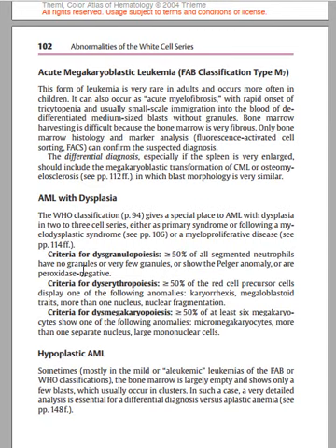The second one is the criteria for dyserythropoiesis, when you have greater than 50% of red blood cell precursors displaying the following anomalies. You have karyorrhexis. If you have a megaloblastoid appearance, meaning megaloblastic cells present in the bone marrow, or if you have more than one nucleus or nuclear fragmentation in red blood cells, you can think of a dyserythropoiesis disorder.